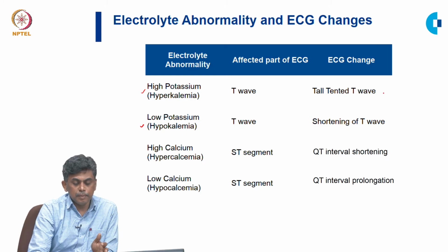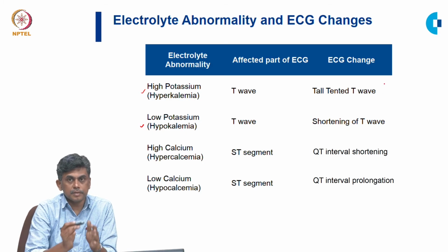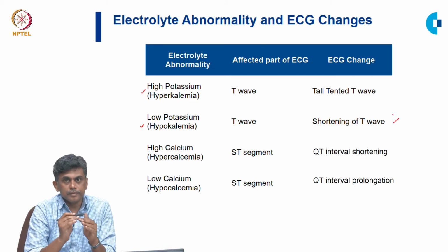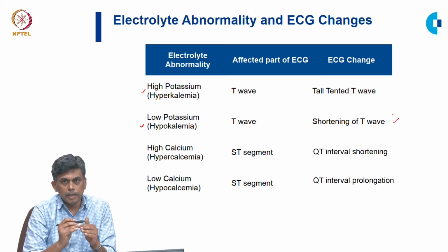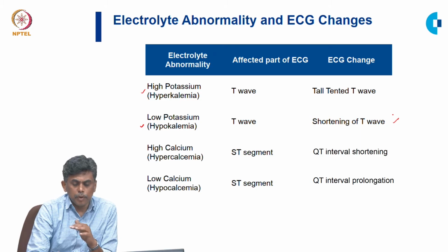Now, what changes will be there in the T wave? In hyperkalemia you get tall tented T waves, and in hypokalemia you get a very short T wave. The T wave will actually become lost. Okay, that is the important point there.